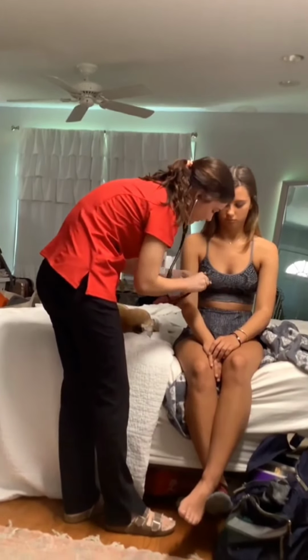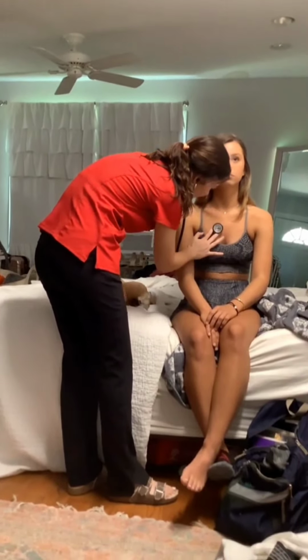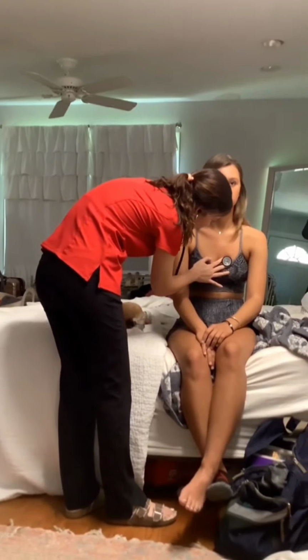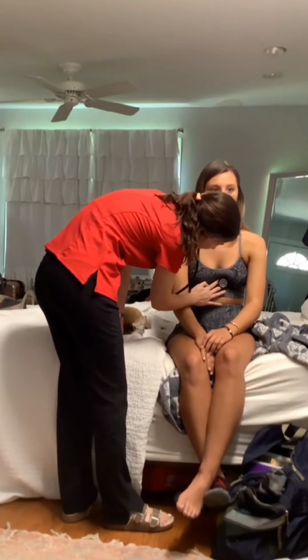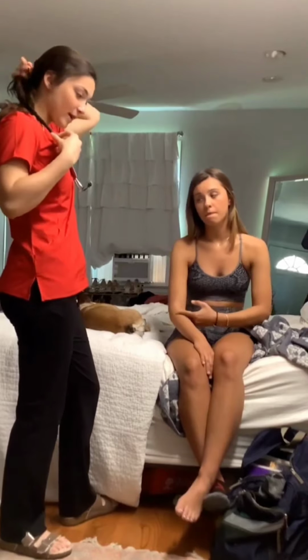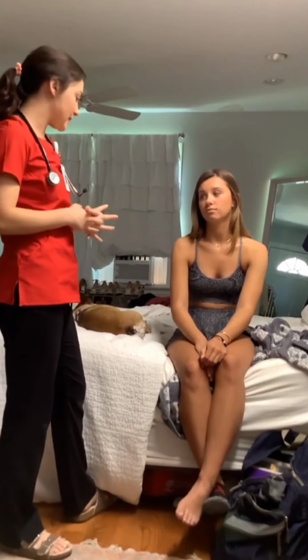And I'm going to go ahead and do that again with my bell. So aortic, pulmonic, Erb's point, tricuspid, and mitral. And I'm going to note that the rate and rhythm of the sounds were regular with no sinus arrhythmia and no pulse deficit. And I would note that S1 was heard louder at the apex and S2 was heard louder at the base. Okay, next I am going to check some heart sounds.